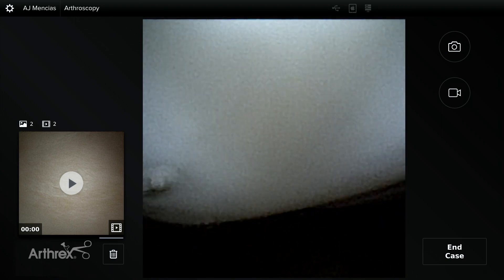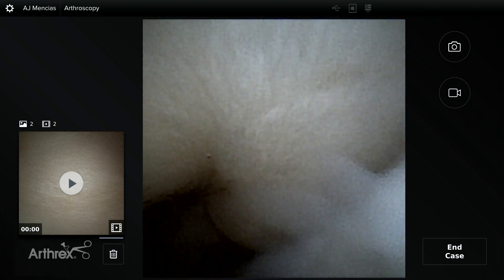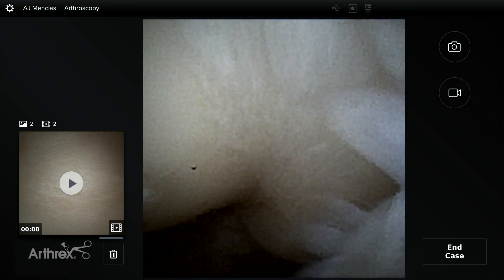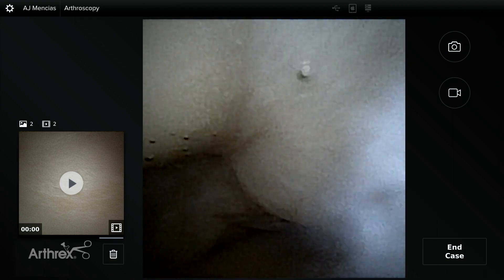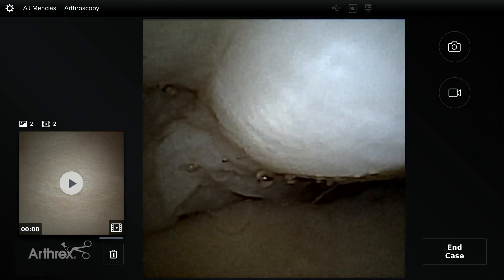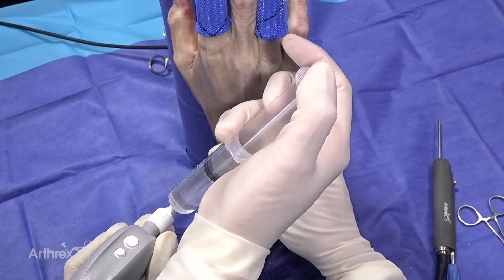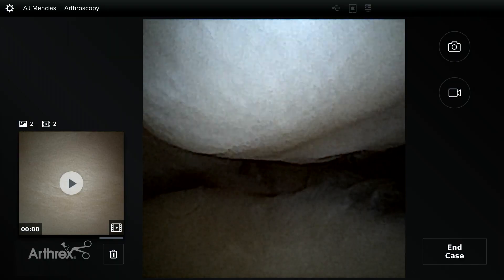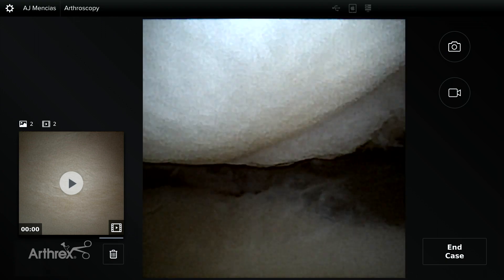Those of us who do a lot of wrist arthroscopy know we're always trying to look at the dorsal side of the scapholunate ligament, and I think you can see the dorsal side clearly here. Also visible will be a dorsal ganglion and the root of the dorsal ganglion. The nanoscope will give us the ability to diagnose and treat these dorsal carpal ganglions — which we see a lot of in hand and wrist surgery. Looking at this scapholunate ligament, anyone would probably say it has a patchy appearance, with no step-off between scaphoid and lunate from the radial carpal side. But as with most wrist arthroscopy, the only way to really diagnose the amount of instability is from the midcarpal side.